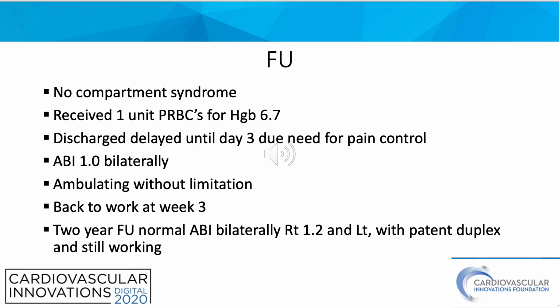Well, I hope you enjoyed this case. I think it showed us a lot of different techniques as well as complication management, things to consider such as type and crossing prior to the procedure, making sure you have stent grafts, making sure you should be doing this kind of procedure in your hospital, whether or not you're a tertiary care hospital. So lots of things to consider.